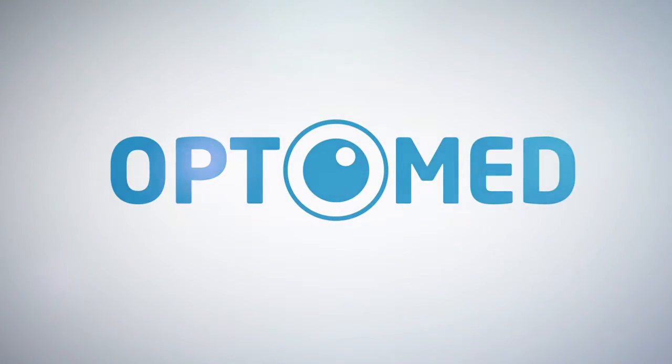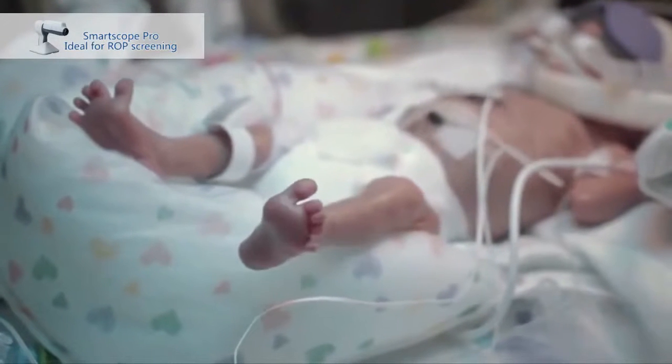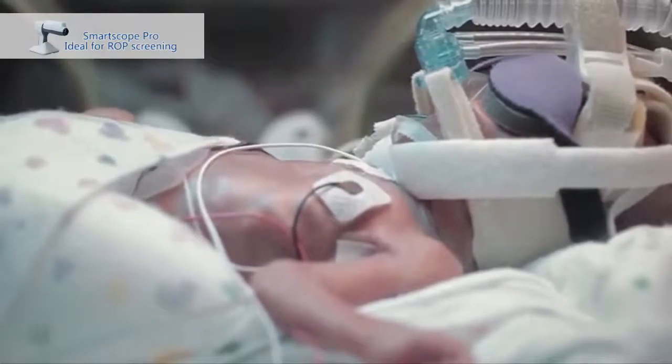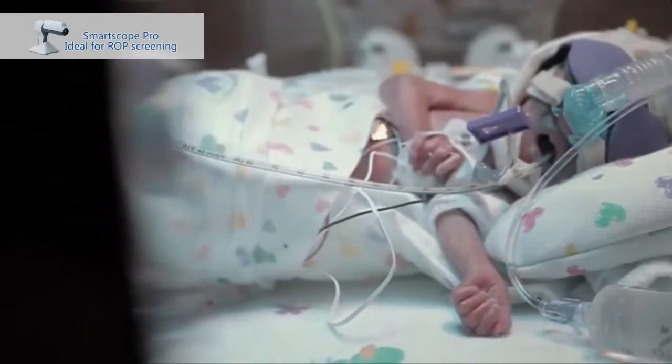Optomed Smartscope, simply brilliant. With the development of medical science, the survival rate of premature infants is increasing. But consequent problems like retinopathy of prematurity are threatening premature infants with visual loss.